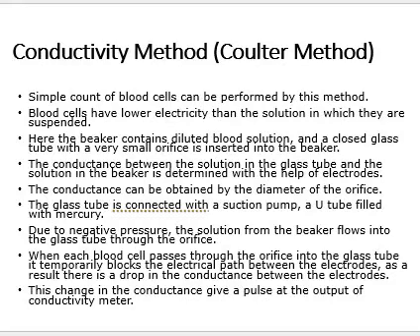The size of the hole will be very minute, so that only the WBC, or only the RBC, or only the platelets can pass through it. Only the platelets can pass through it, so it is a very small-sized hole.